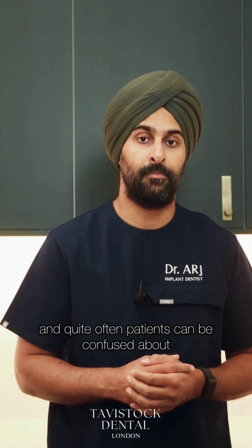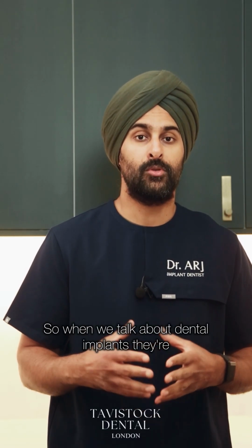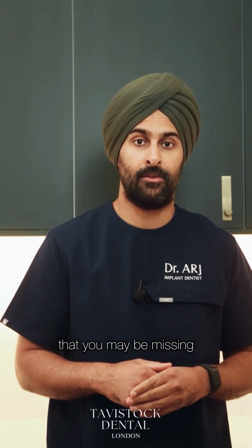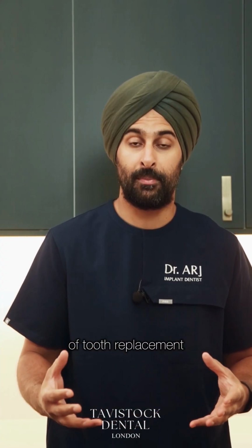And quite often, patients can be confused about what exactly a dental implant is. So let's run it through. When we talk about dental implants, they're really there to replace any teeth that you may be missing or you may be about to lose. So it's a form of tooth replacement.